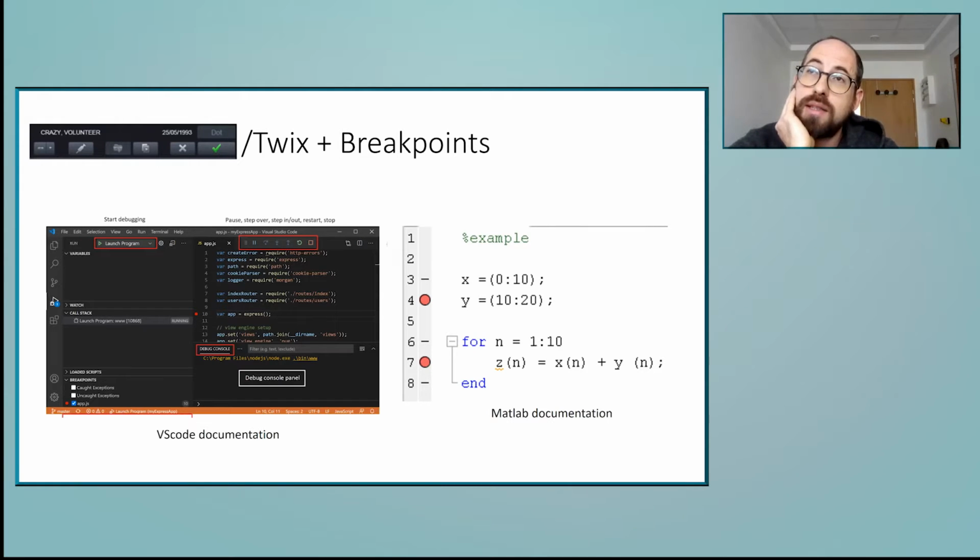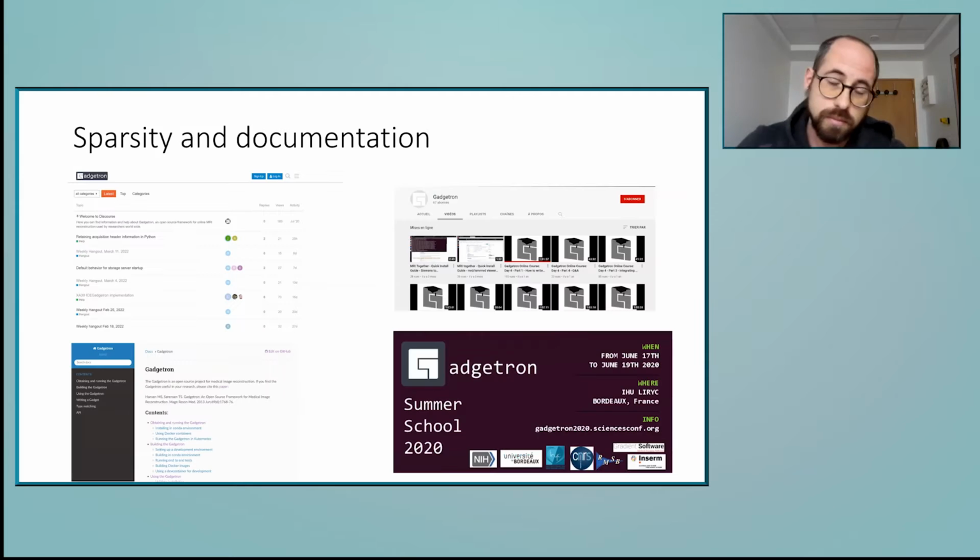A practical case could be, you have a sequence and you haven't done the reconstruction, so you can run it on the Siemens, and you can remove the ICE reconstruction in the IDEA command tools, and so you get the data saved, and then with tricks you can call the ICE Gadgetron functor to send the data to Gadgetron, and then you can play with it and send it back to the scanner.